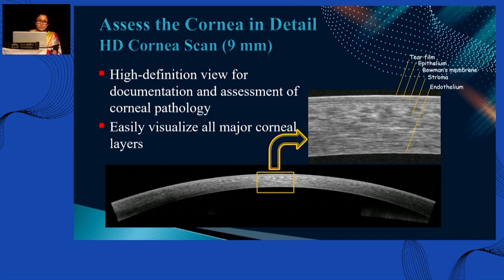This can also be used to assess the cornea. I'm not going to go into details.